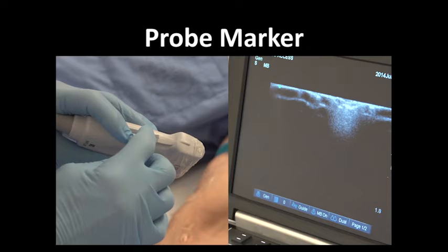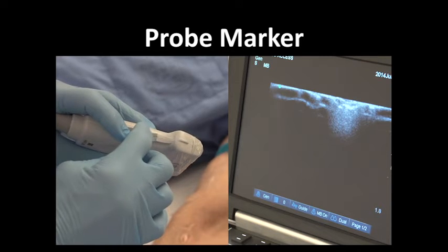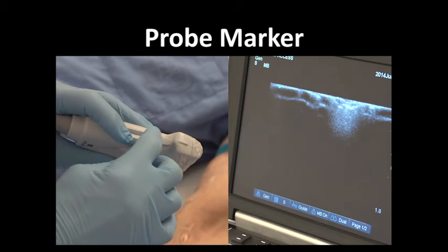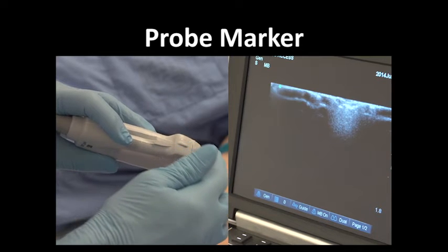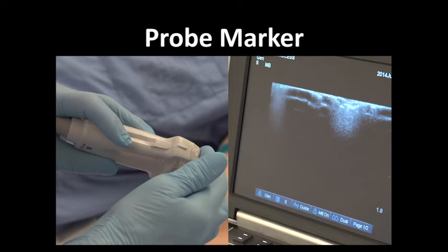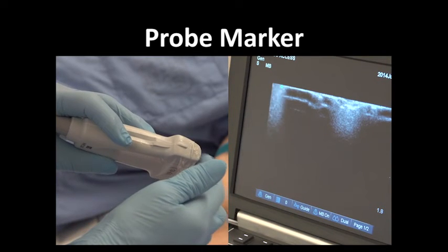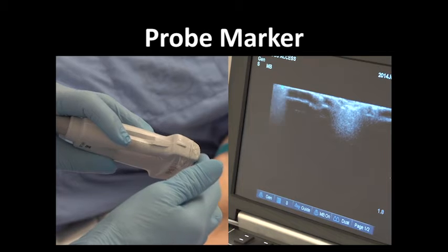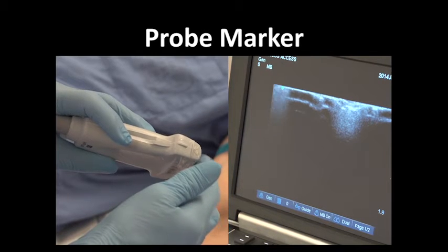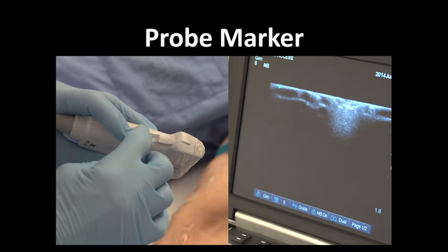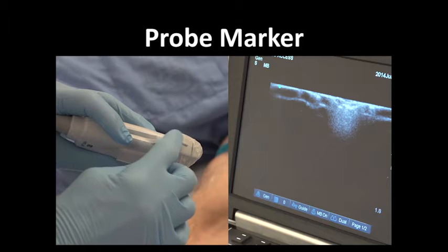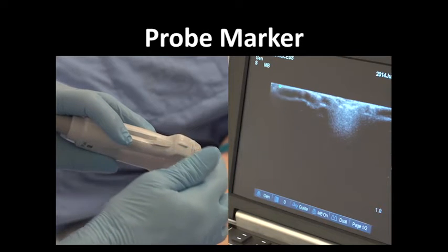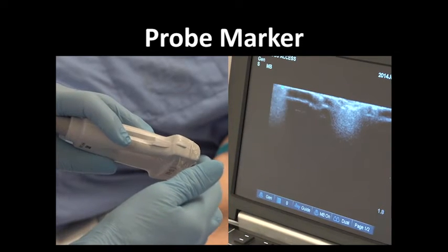Before starting your ultrasound exam, take note of the probe marker and the corresponding dot or screen marker. Tapping on the side of the probe near the marker can help confirm which side the marker is located on. The marker on the probe and the dot on the screen should be kept on the same side of the operator's line of sight at all times.